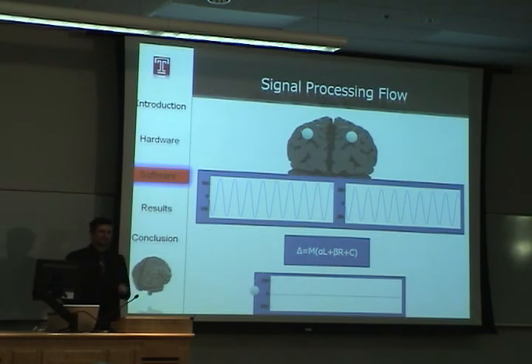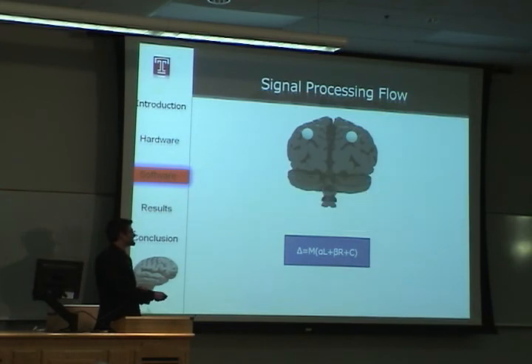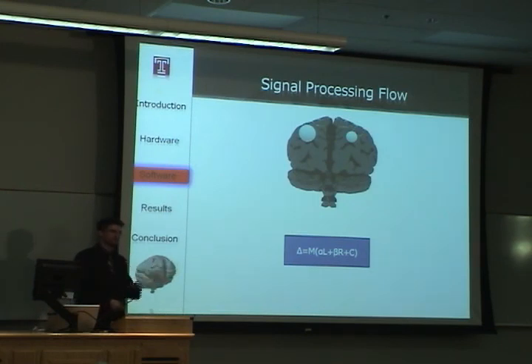So that's something that we would hope that you can accomplish, but obviously your brain's not going to produce perfect sinusoids, and you're also not going to always agree with one another. Eventually your brain will figure it out. So what we're going to look at right now is what if the brain were to increase the amplitude on one side, one hemisphere of the brain. In this case, it's going to be the left hemisphere.